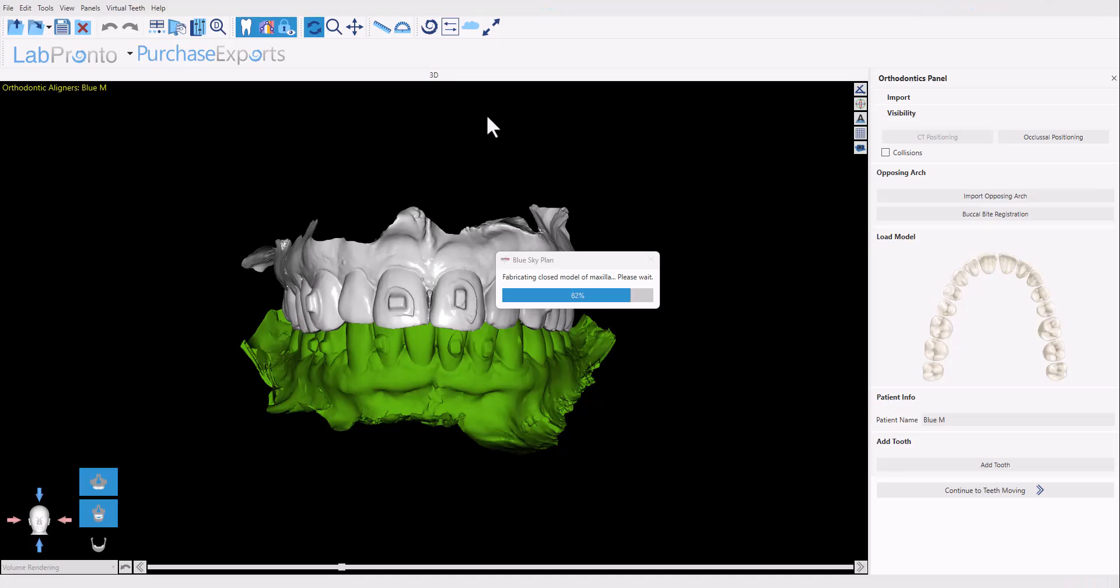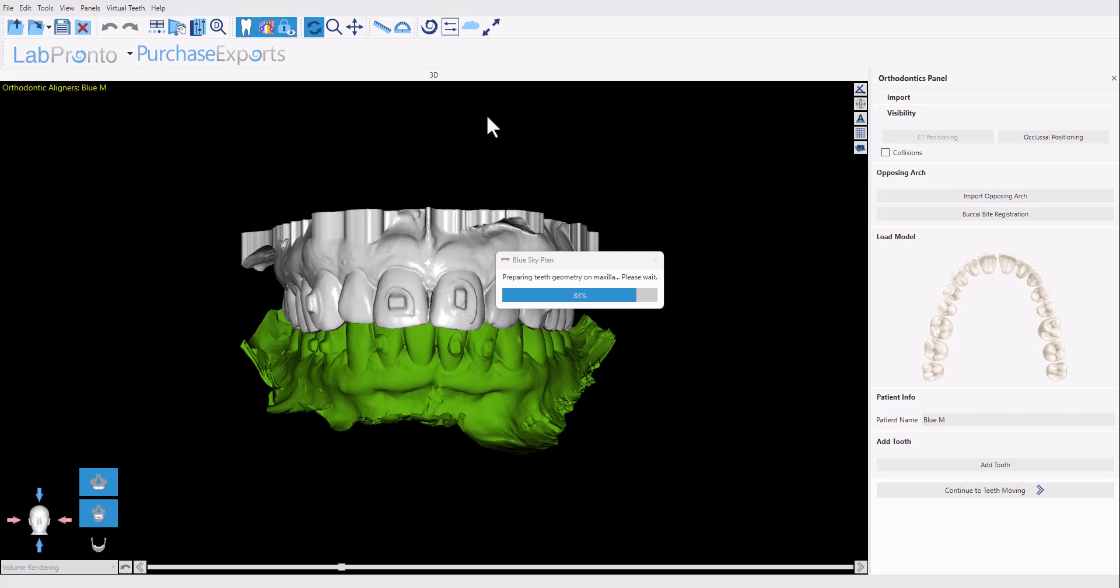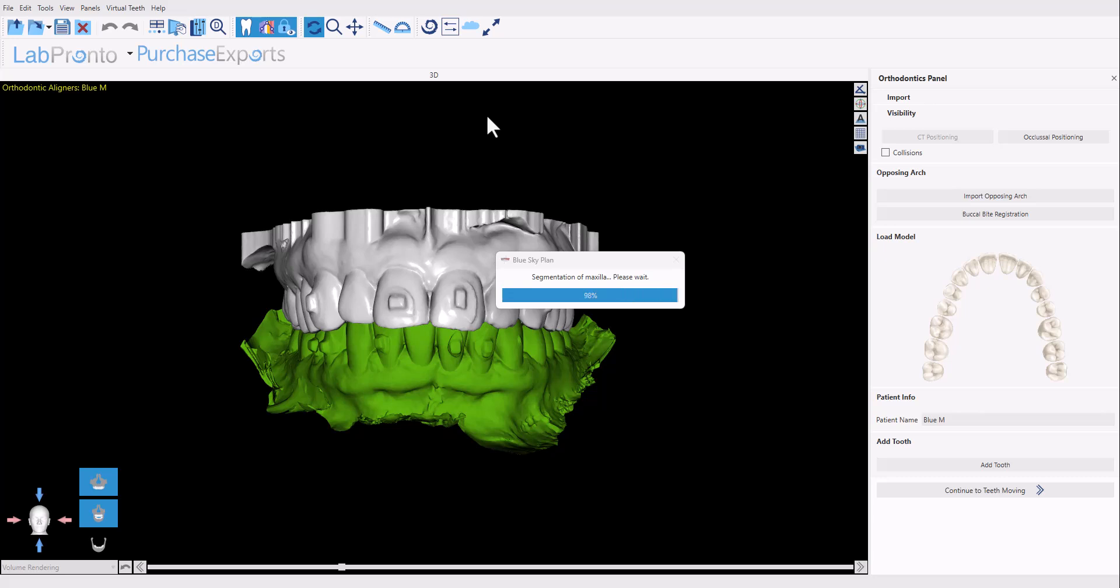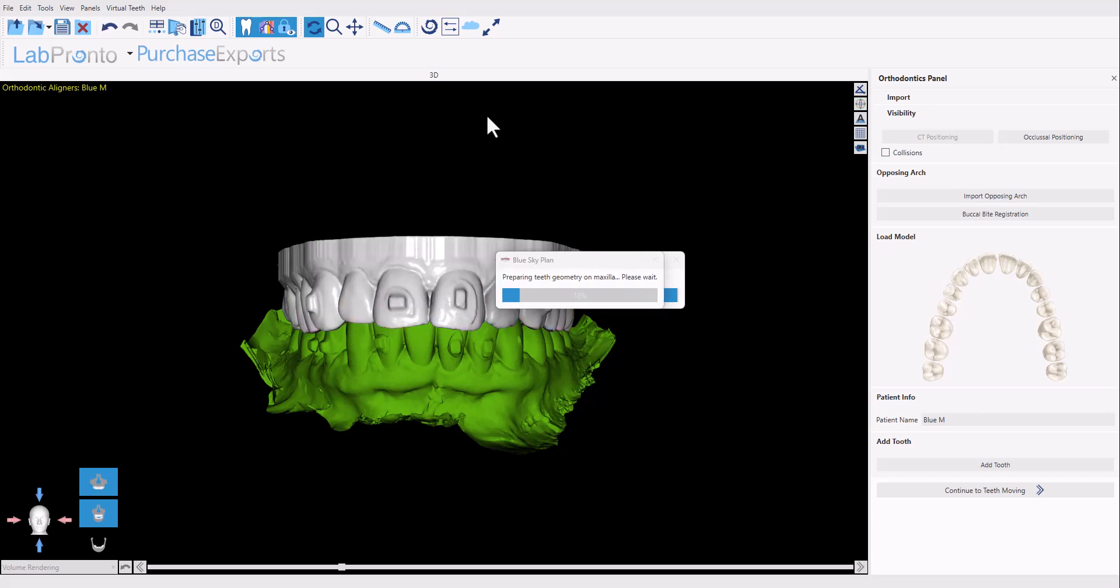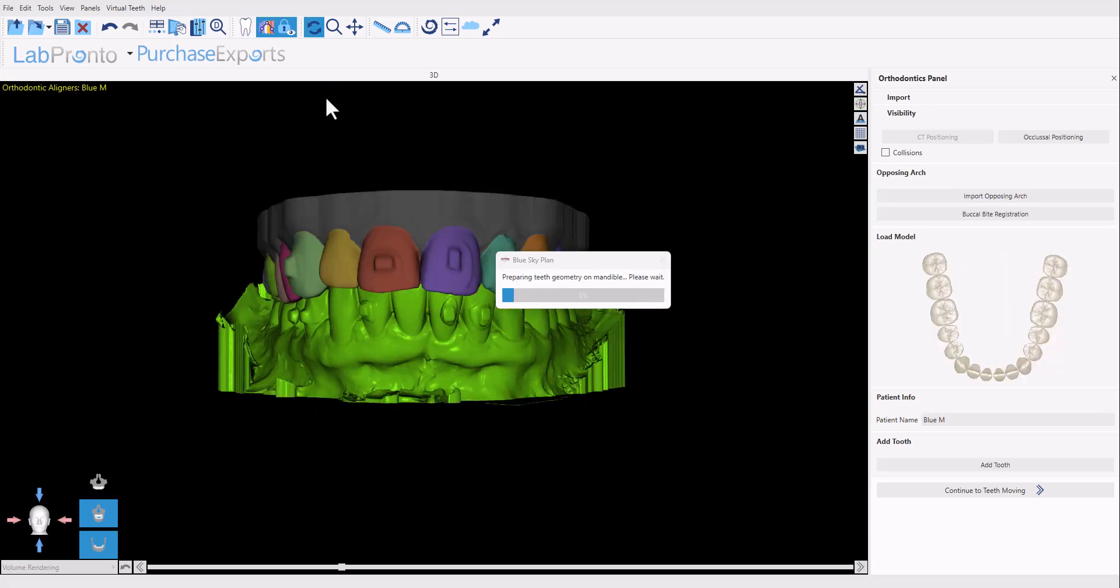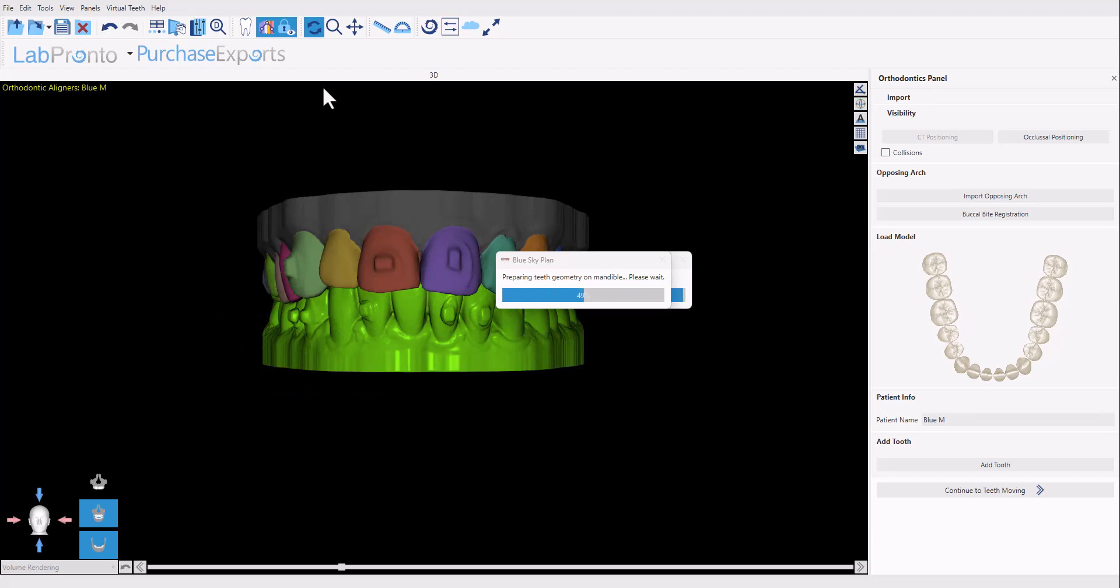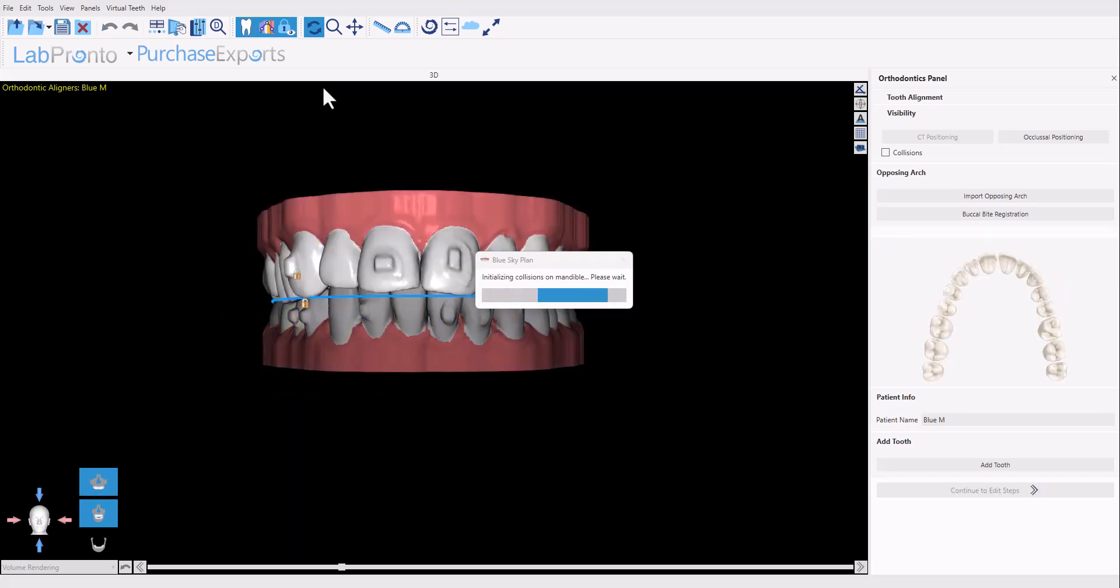Now we are watching the automatic data preparation functionality. The software is automatically running through the steps of aligning the models in space, annotating them, segmenting them, cleaning up the models themselves. All of this is being done completely automatically without any user intervention. The software is going to take the user automatically to the teeth setup stage, significantly reducing the time it takes to prep the data for aligner digital tooth setup.